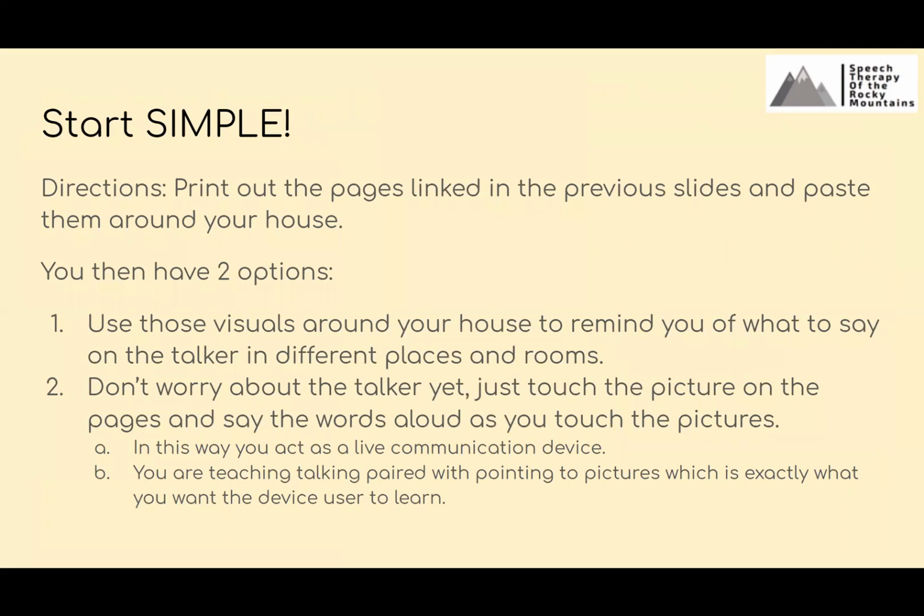So my suggestion, start simple. Print out these pages and put them around your house. You have two ways to use them. You can use them with a device or as a reminder for a device, or you can not worry about the device just yet and touch the pictures and talk as you're navigating around your house and as you're doing your things, just like you would talk to yourself out loud sometimes when you're first teaching someone language, communication, and vocabulary.